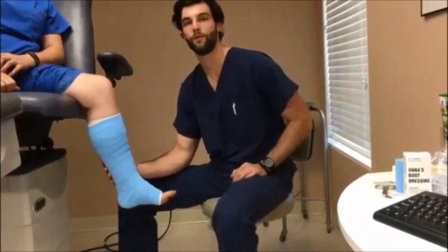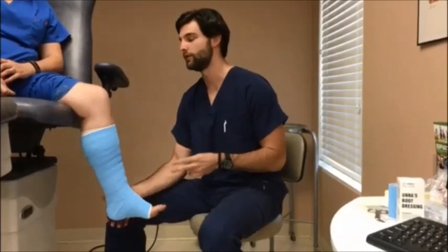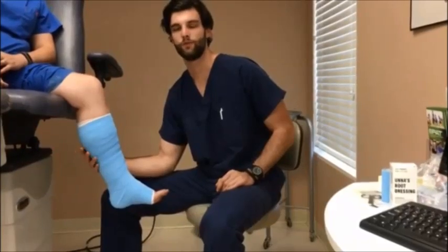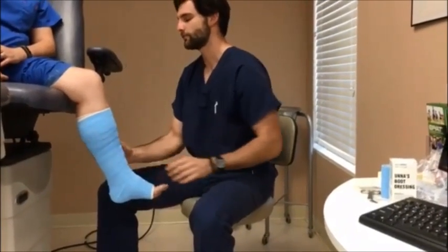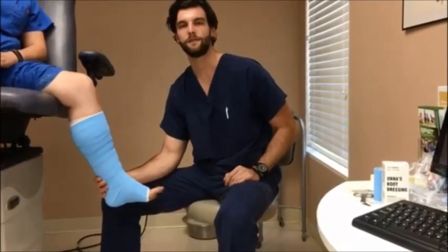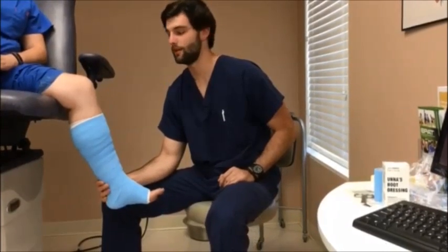So after you apply the Unna Boot, you have to remind the patients of 3 things. 1, don't get it wet, it's just like any other cast. And if they do get it wet, give us a call immediately. 2, if you have any cramping in the back of their leg, in their calf, call the office or go to the ER if we are close, to prevent blood clots, because those are very dangerous. And then usually the doctor is going to put them in some kind of boot or post-op shoe depending on the diagnosis, and want to see them back in a few weeks. And that's the application of an Unna Boot.